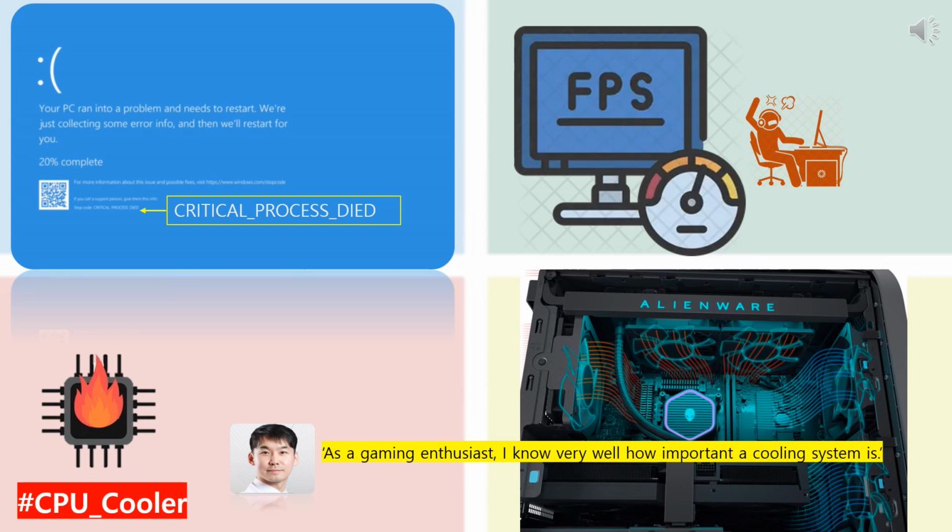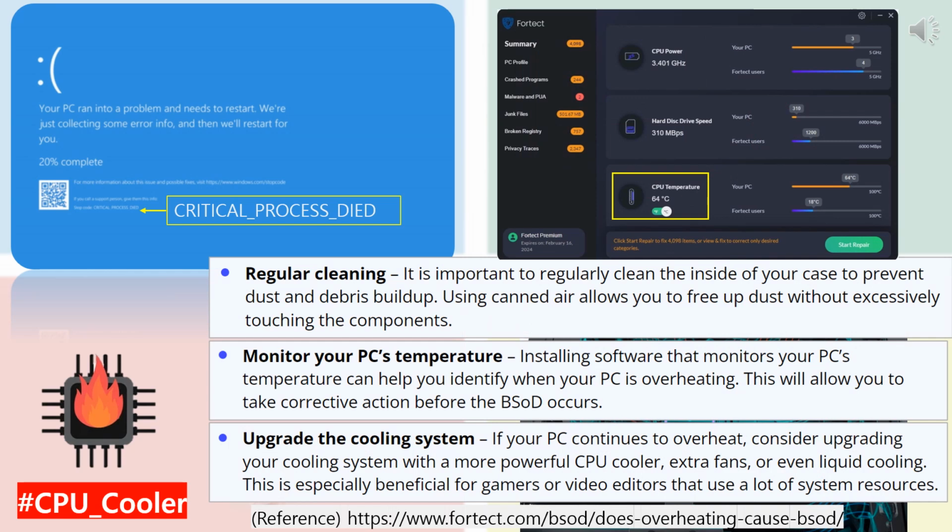Many people reported seeing the blue screen errors 10 to 15 minutes into playing their high-resolution games, but they would never see this while performing general computer tasks. This is exactly what dentists report while scanning. If there is an issue with the CPU cooler, we can verify it using CPU temperature monitoring programs. Video game enthusiasts continuously monitor CPU temperatures and repair or replace coolers as needed.